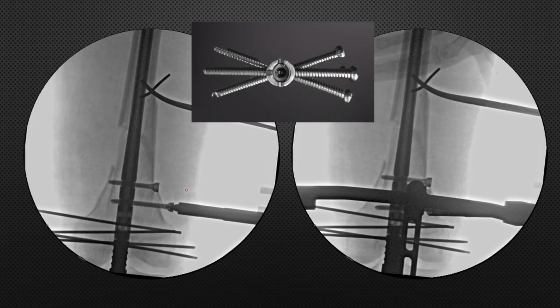Now we have started a process of distal locking. You see, these are threaded screws. These are not bolts. They are getting engaged inside the nail holes. So 4 screw options are available in the nails that we are using, but you can use the other nails also, which are providing more screw options. More screws passing through the nail means more stability.